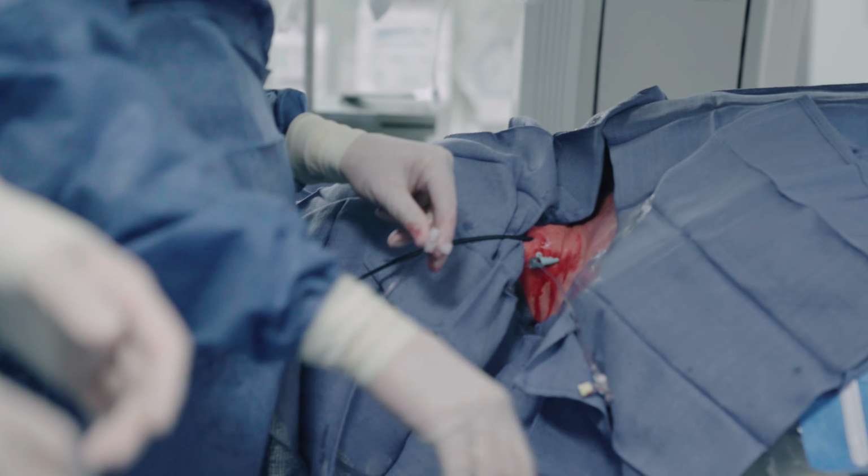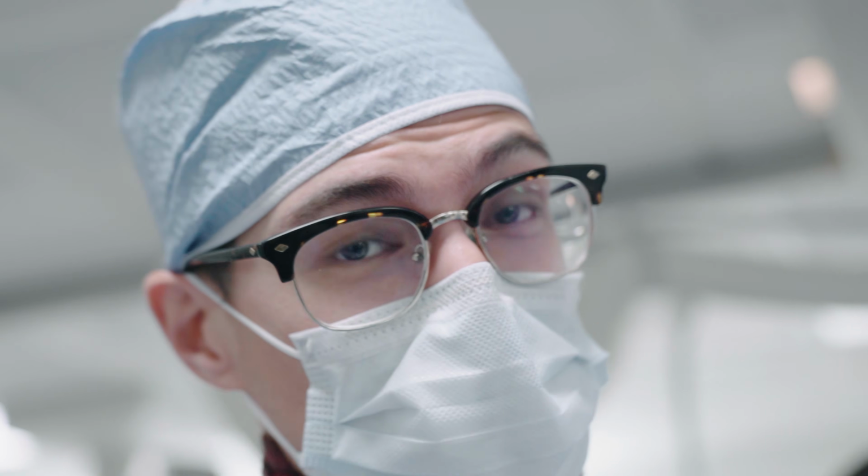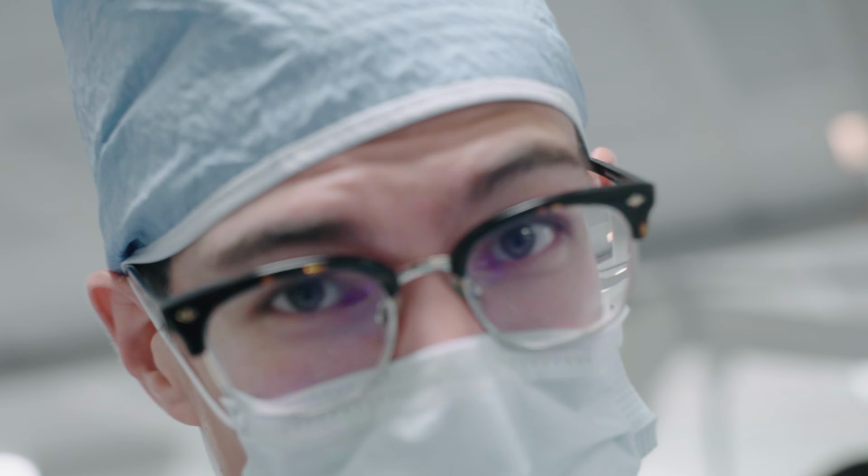So we're just measuring the blood pressure in the right atrium of the heart to make sure the patient's not in right heart failure, because if we do a TIPS in that case and the pressures are too high, we could actually make their heart failure worse.